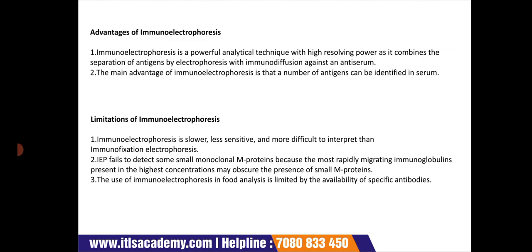The main advantage of immunoelectrophoresis is that a number of antigens can be identified in the serum. Every technique has certain advantages and certain disadvantages, or you may call them limitations. Whenever we talk about the advantages, it is one of the most powerful techniques, with a very high resolving power.